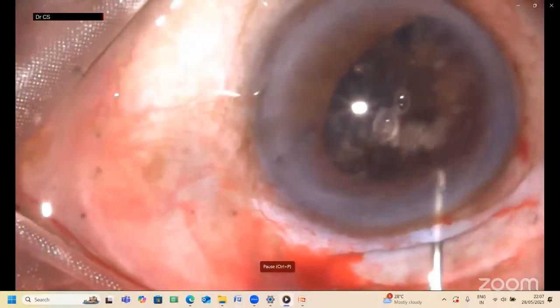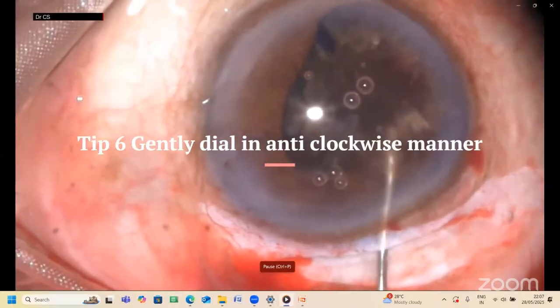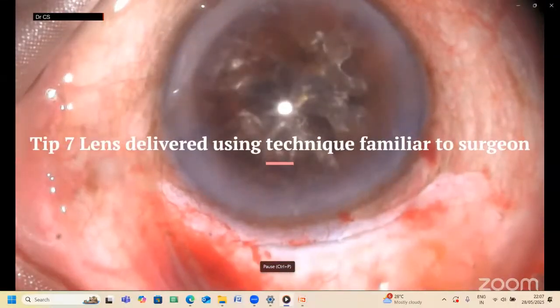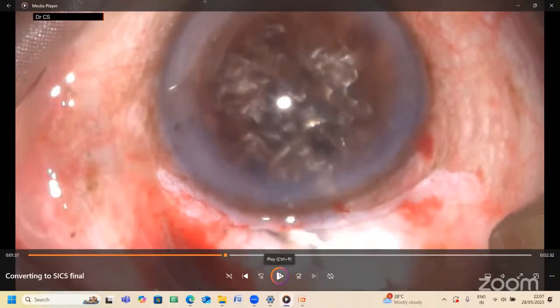So here, because now already it's not easy because it's not a single nucleus. It's been manipulated. I'm depressing the scleral tunnel to again remove it from the anterior chamber. As shown by previous surgeons, viscoexpression or using a vectis or the fish hook technique which Dr. Mahanta showed beautifully. Whatever technique works well in your hand, ensuring that in this case, for example, there was no PC rent. So it's critical that we maintain the anterior chamber inflated adequately with visco, protect the endothelium. At the same time, we don't land up rupturing the PC, while everything is going smoothly.